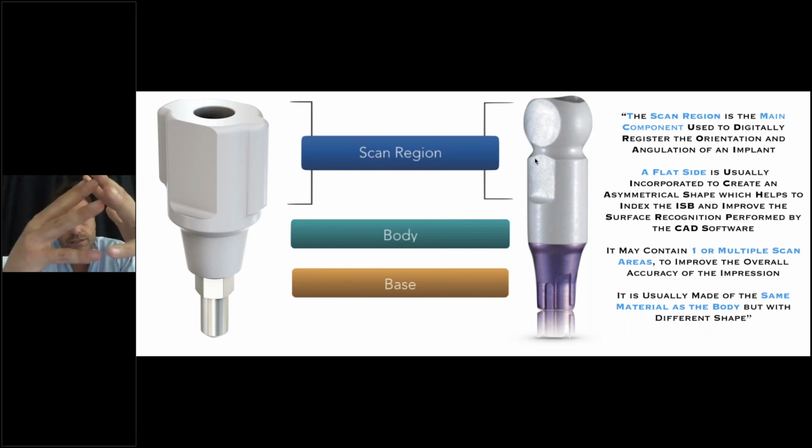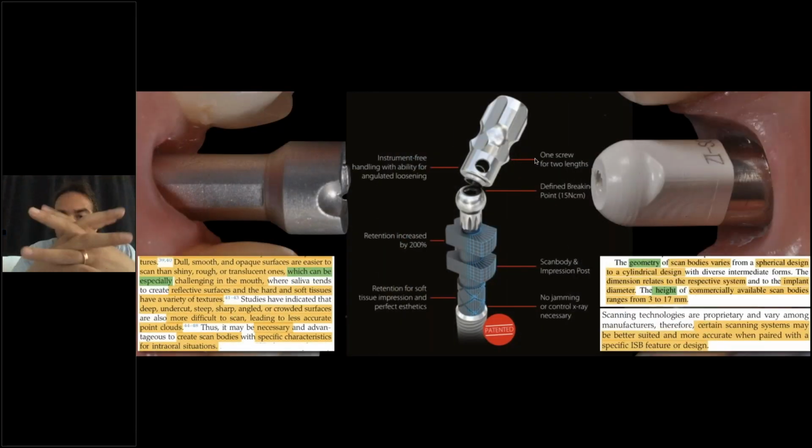The base, and here on the left side you see the three implant scan body, it's important that it is titanium in order to have a connection which is titanium against titanium, to improve the accuracy. This is the 3D touch. So you see, I'm just sharing with you many different scan body materials and many different scan body designs in order for you to understand that by choosing the scan bodies, you have different things to detect and different things to know.